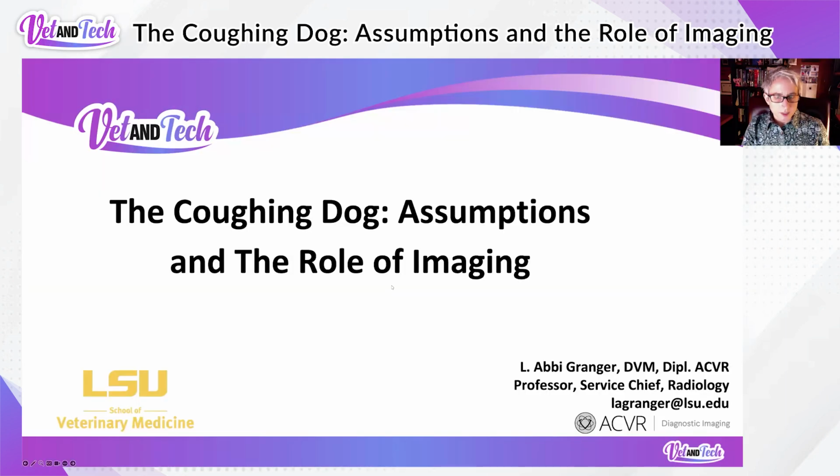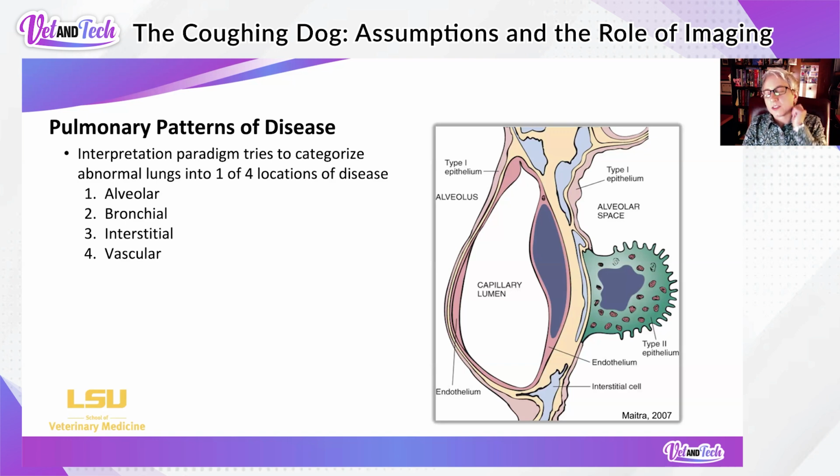Today, I'm talking about a clinical finding. As a radiologist, we are often asked to answer a clinical question in addition to giving an interpretation of images. When you look at veterinary medicine lung interpretation, I always teach my students that usually if you are imaging the lung, there is a specific reason why. Particularly in the chest, though, a lot of the reasons why may actually be screening. It may not actually have a clinical sign associated with disease. A metastasis check would be a common reason to obtain chest radiographs in a dog that has no clinical sign.